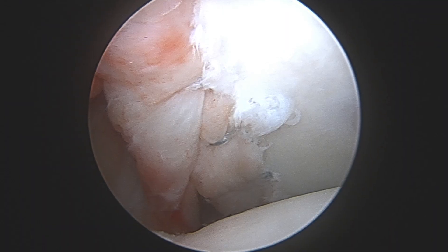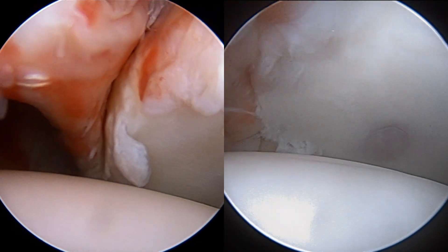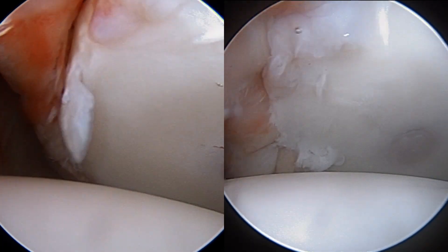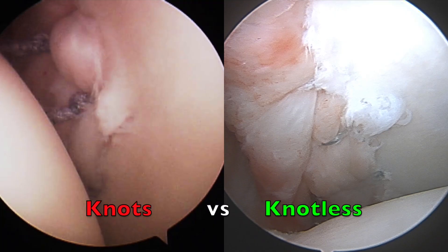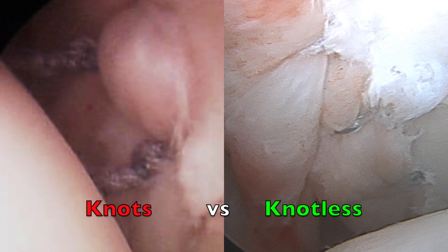Here you can see our final repair, and as I apply an anterior force to the shoulder you can see that it no longer dislocates. Placing the before and after side by side, you can see we've restored the stability of the shoulder. You can also see the difference between the old knotted construct and the knotless mechanism, and how that would be less abrasive to the cartilage surfaces.